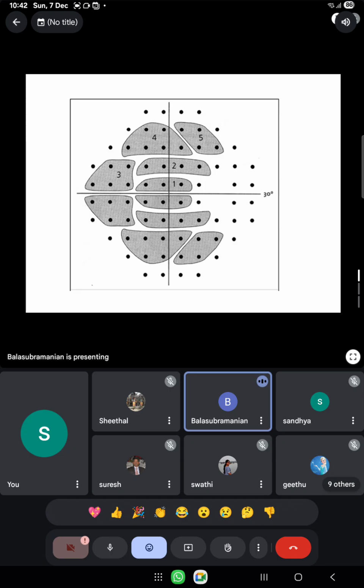Why are they comparing up and down, and not right and left? In glaucoma, it is... So is this test only useful for glaucoma patients? Glaucoma hemifield test, yes, that answer is right. But what is the reason for assigning numbers and separating it into zones?